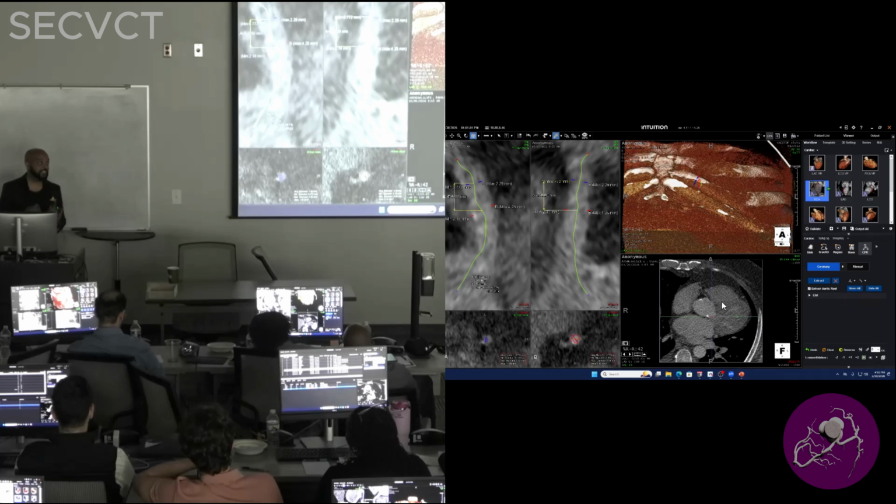And there are times that I do not agree with things, and I'll send them back to HeartFlow. We'll get another recon and see, hey, do I agree with it? But ultimately, you guys are really responsible for quality control and making sure these images are perfect and pristine to increase your sensitivity for stenoses and potentially intervention on someone. Make sense? Cool. I know this has been a long day. It is almost 5. I have no other cases to show you.